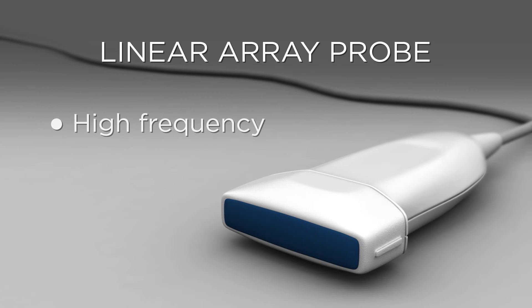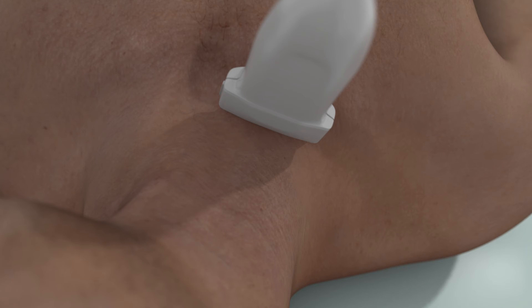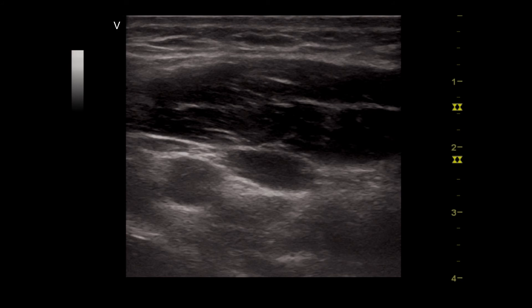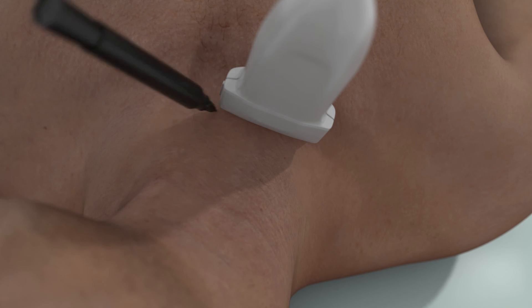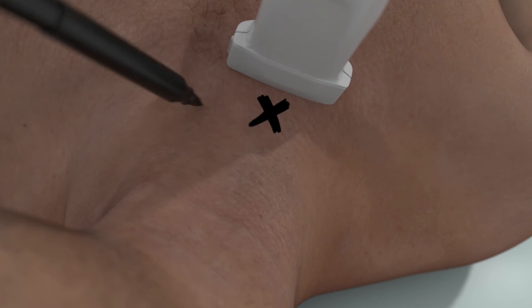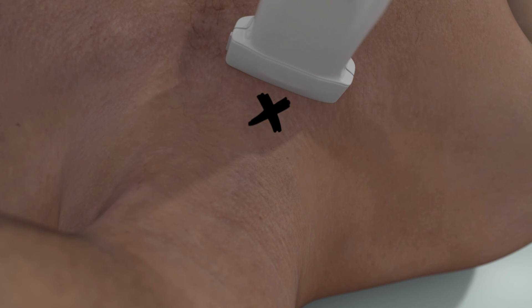A linear array high frequency probe is ideal for this procedure. An initial transverse view of the carotid artery and jugular vein is obtained 2 to 3 centimeters above the clavicle, between the two heads of the sternocleidomastoid muscle. The probe should be positioned so that the jugular appears in the exact center of the screen. The goal at this point is to mark the optimum area for needle insertion prior to creating a sterile field, and the mark should align with the center of the probe.